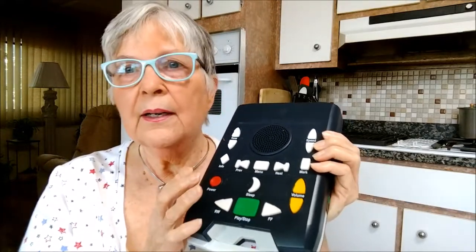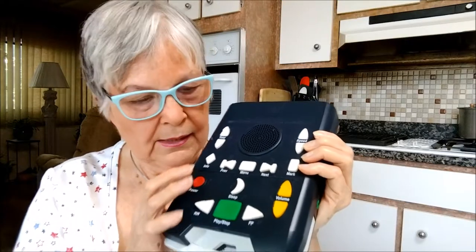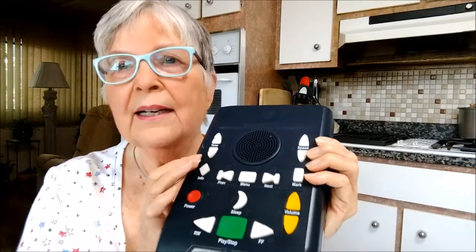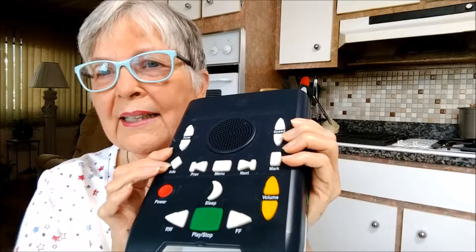The device narrates each button when pressed. For example, pressing the power button plays: 'Battery charge remaining: 19 hours. Battery powered. Press this power button to turn the player off. Press the power button again to turn the player back on. If the player is running on battery and not playing a book, it will automatically turn off after 30 minutes to preserve battery power.'